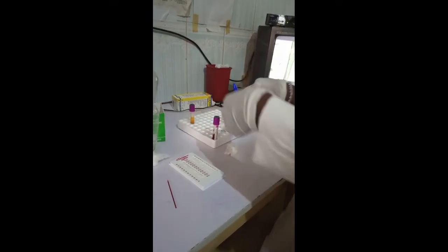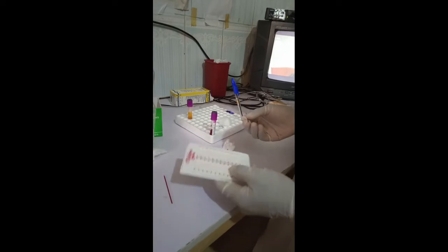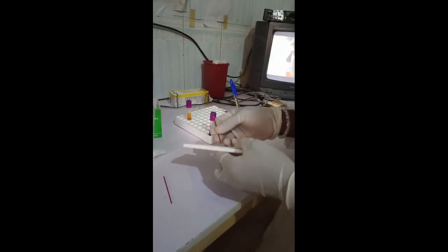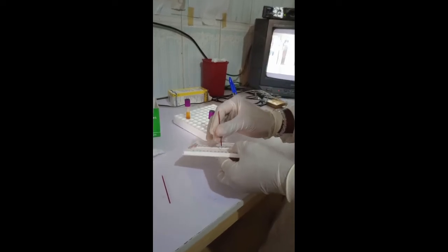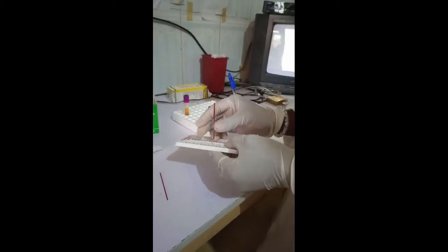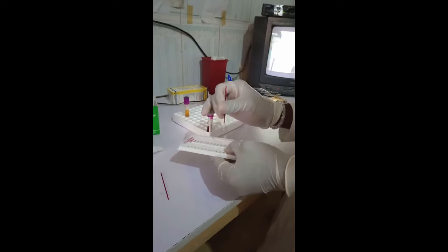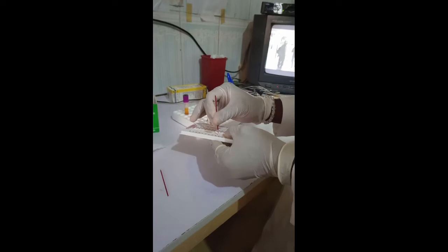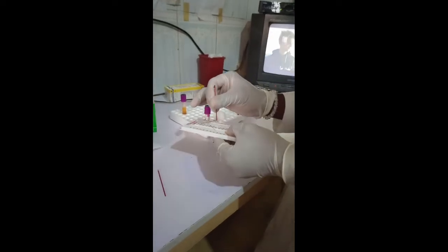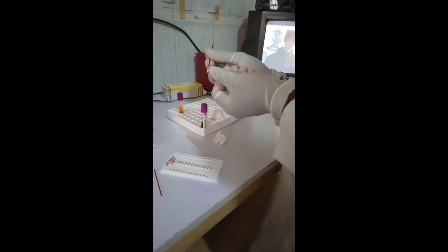After which you seal the capillary tube. Seal one end of it with your sealant. You pin and rotate a bit. Be sure not to press so hard because the tube can break and the blood will spill on you. So you pin and rotate a bit. See the sealant entering the tube. You can see the sealant inside the tube. That means it has been sealed.